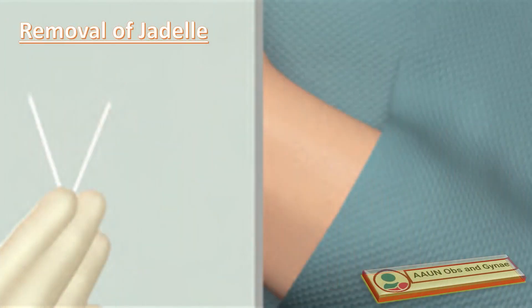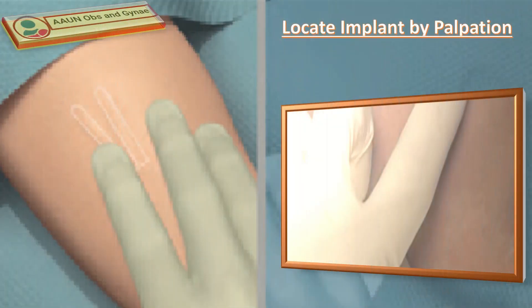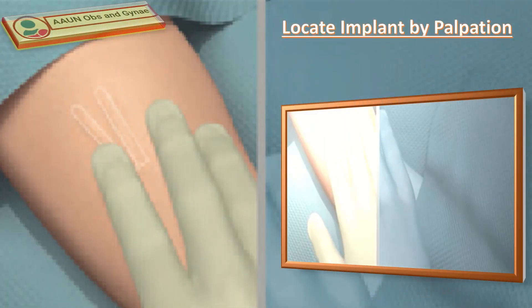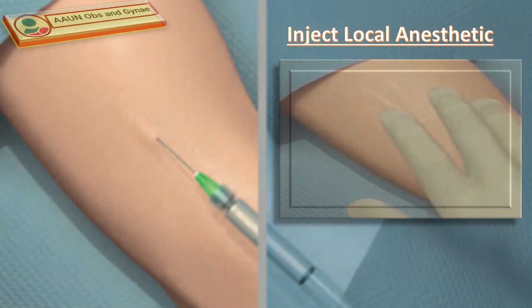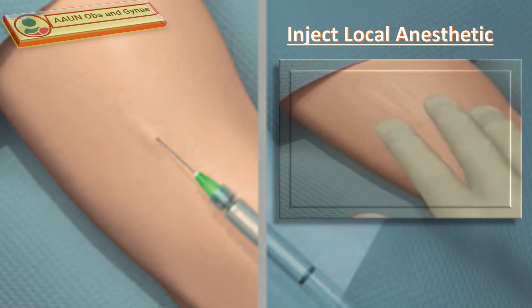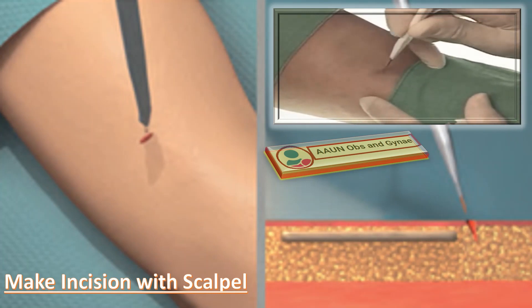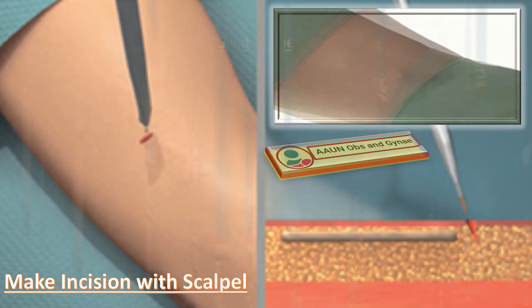For removal, the patient shall be in a similar position and similar aseptic technique shall be applied as for insertion. First, locate the implants by palpation, possibly marking their position with a marker pen. Inject a small amount of local anesthetic under the ends of the implants that are closer to each other. Make a 4 mm incision with a scalpel close to the ends of the implants, keeping the incision small.